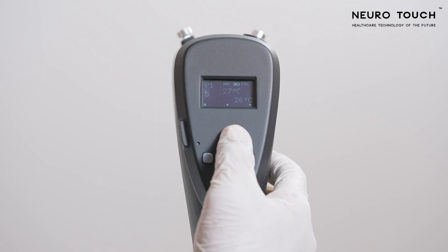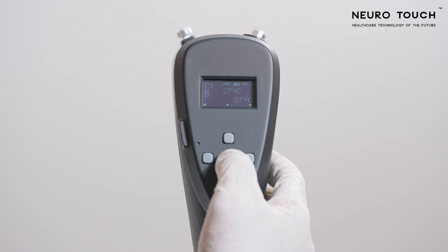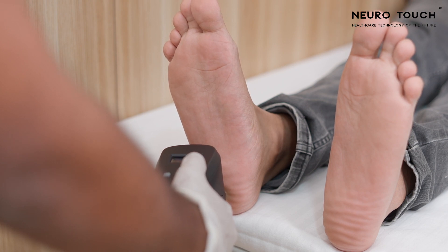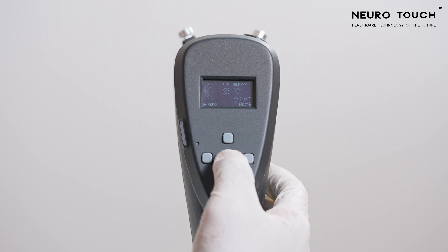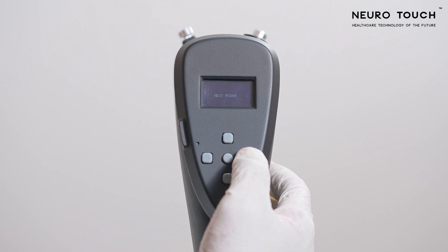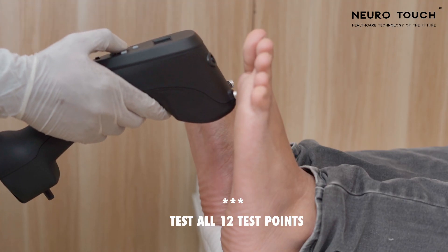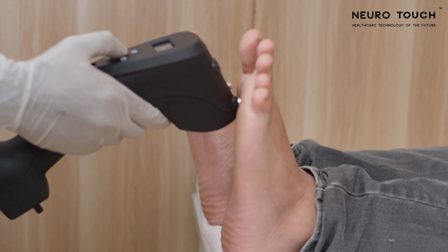Do not hold the hot probe against the test point for more than five seconds, as it may cause a burn injury. If the patient cannot feel the warmth, increase the temperature by clicking the up key and place the probe again on the same test point. If the patient can feel the warmth, press the center key followed by the right key to save the data.